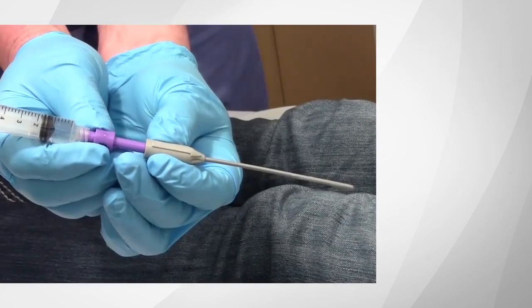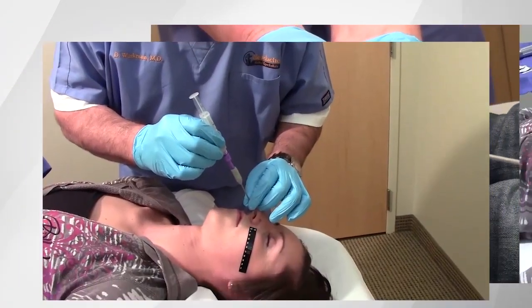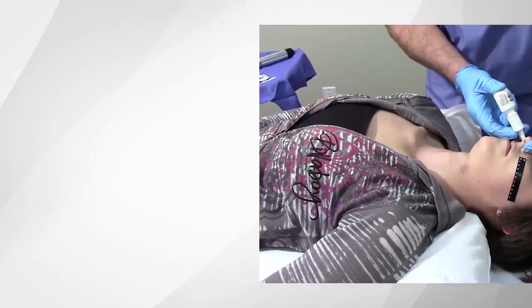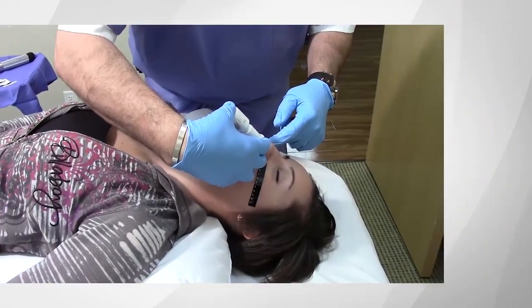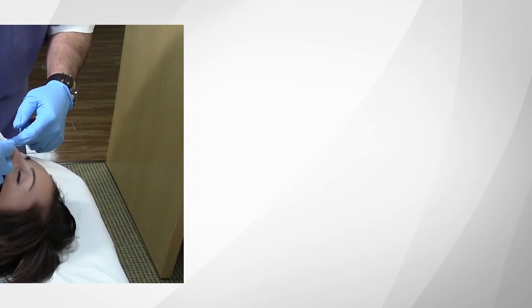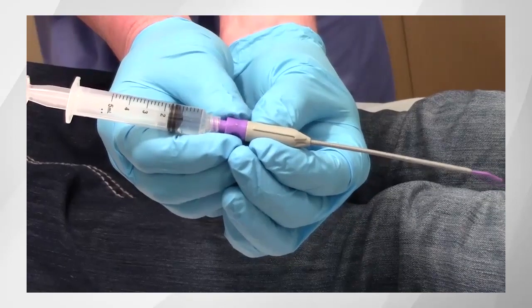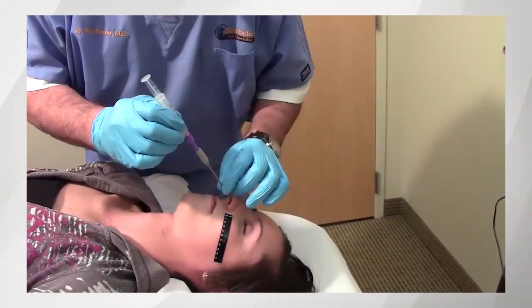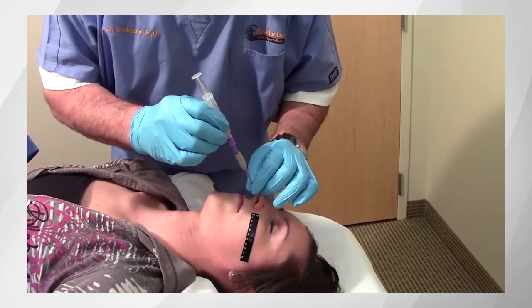These and other important nerve fibers contribute to the central autonomic and sensory components of headache pain. This sphenopalatine circuit can be blocked without needles and without pain. Accurate placement of the local anesthetic can be accomplished in minutes and provides delivery of the anesthetic to the entire sphenopalatine circuit, V2, producing outstanding results. The following step-by-step approach demonstrates how healthcare practitioners can successfully use the SphenoCath to rapidly accomplish sphenopalatine circuit V2 blockade in the management of migraine and other trigeminal-vascular pain syndromes.